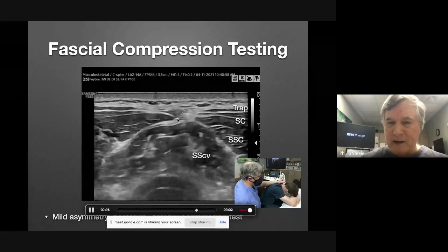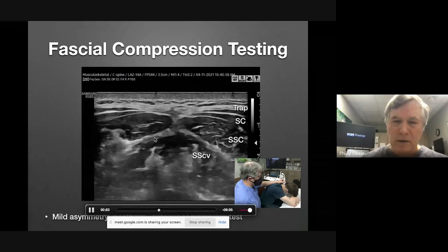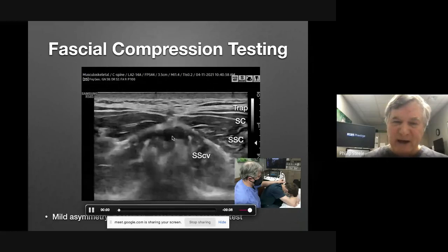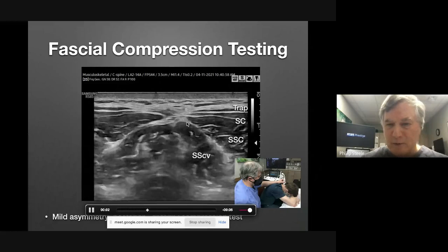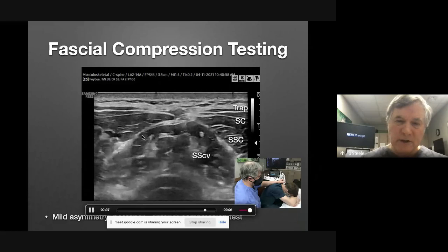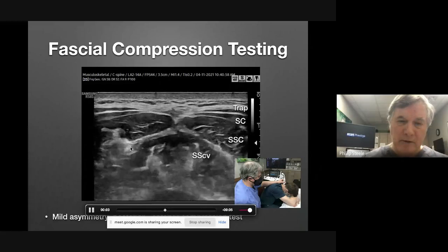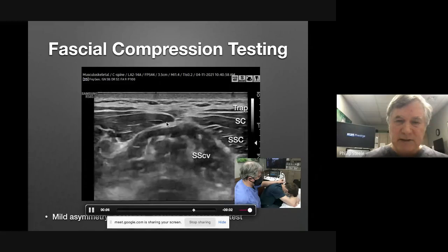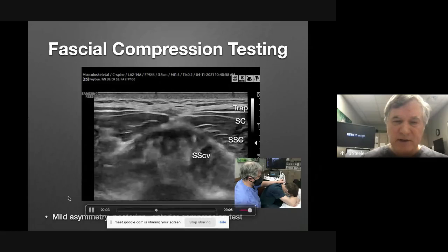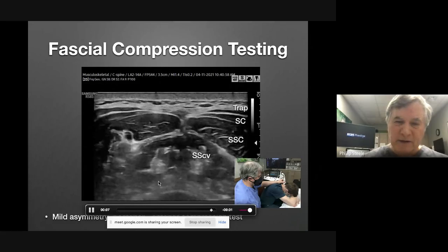And if you look at it, as this pulls away, it pulls this tissue with it. You can see that now. It's pulling that tissue with it. And so the defect is actually not necessarily completely right here, although I end up treating this area. But more importantly, you need to treat this lateral extension. The question is, where's Waldo? I don't know if that expression makes a lot of sense in South America, but where's the pathology? Is it down at the insertion to the facet? Is it in the mid portion, or is it right here? And that's where you'll have to spend more time.